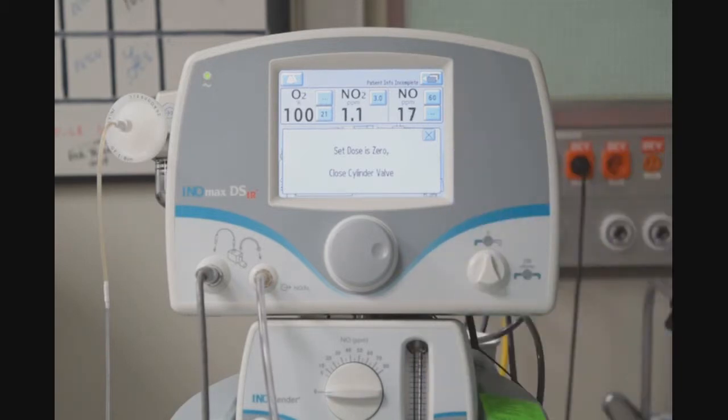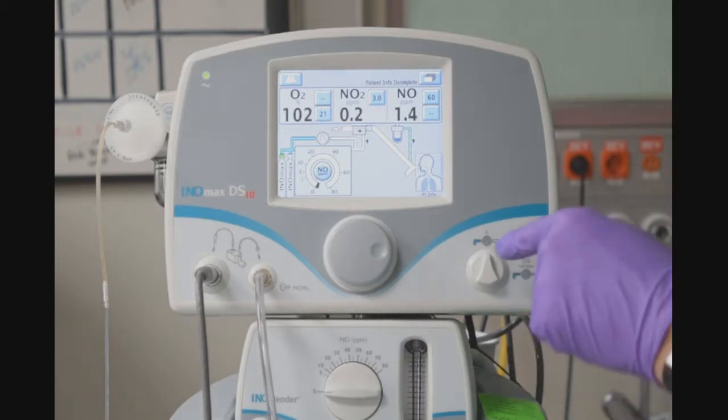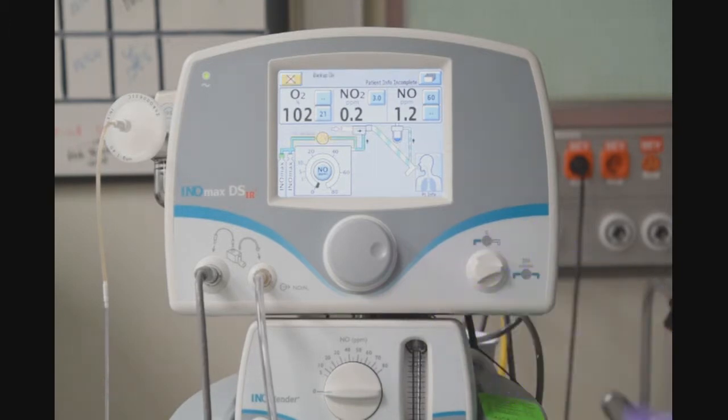I will get a notification saying that the set dose is zero and to close the cylinder valve. At this point, I do not want to close the cylinder valve. Next, I will perform the backup delivery system test. Still ensuring that the oxygen flow is set at 10 liters per minute, I will turn the backup delivery to the ON position — simply turn it a quarter of a turn to the right and you will see that it is activated. This knob should be used for emergency situations in the event that you are not getting any reading, and it will automatically deliver 20 parts per million NO.